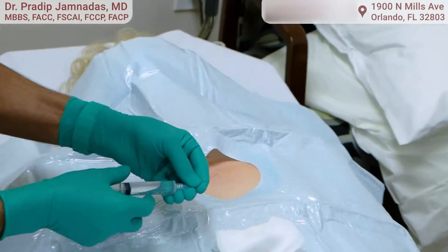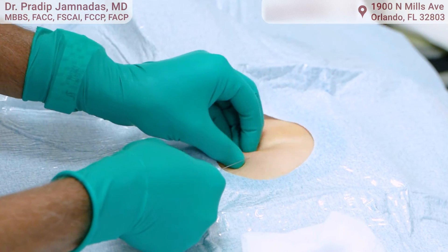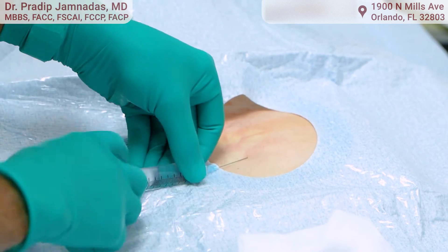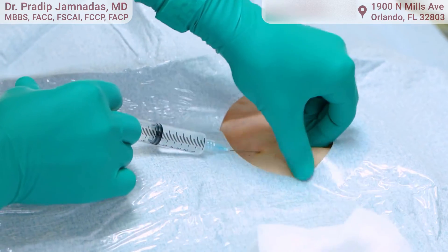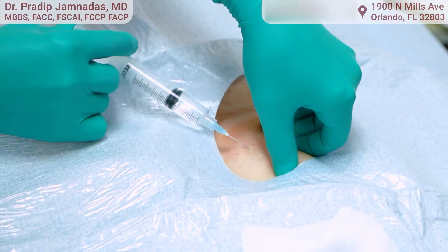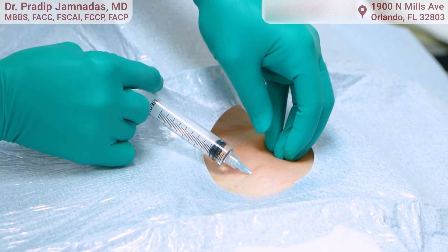I'm going to give a little bit of novocaine now. You may feel a little stinging right here — a little pinch. You're going to feel some pinching and burning; that's the novocaine. This makes it basically numb wherever the needle is going in, and gives you numbness that lasts for about 20 minutes.